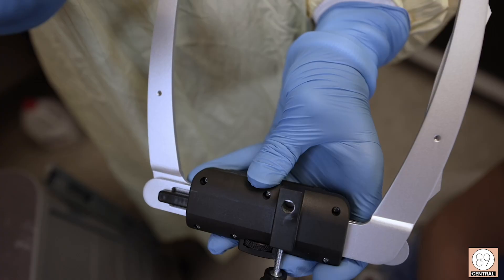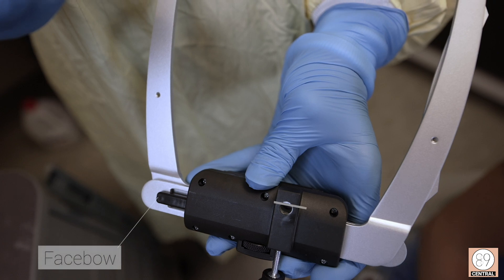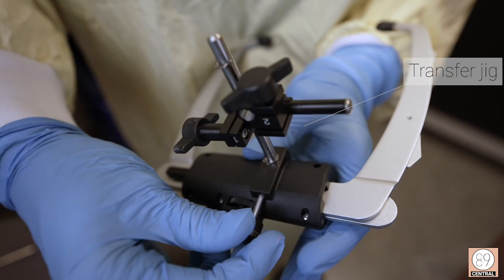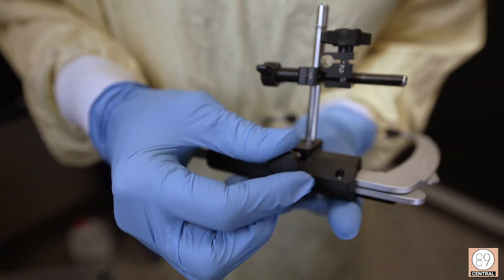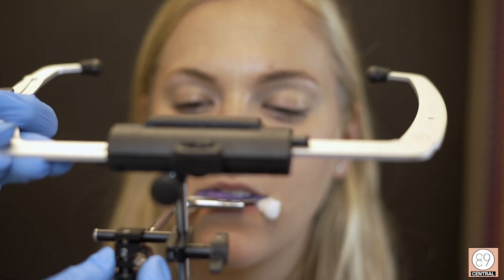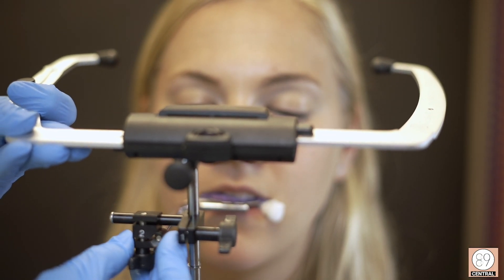On your face bow, you can see this circular area, and you will match that up with your transfer jig. Go ahead and insert your transfer jig onto your bite fork.